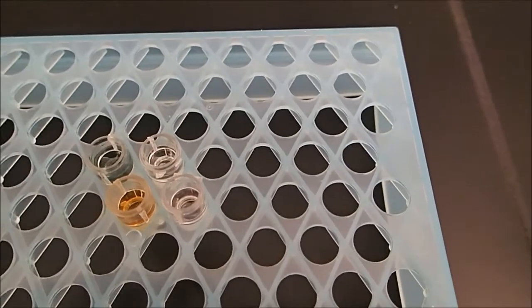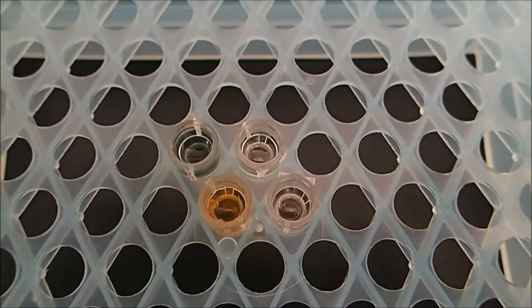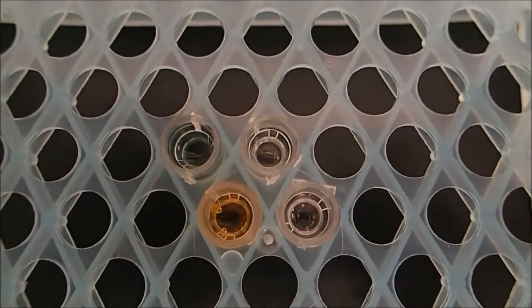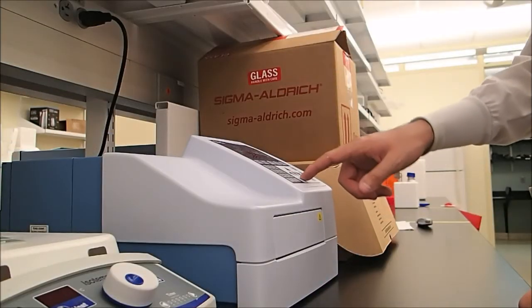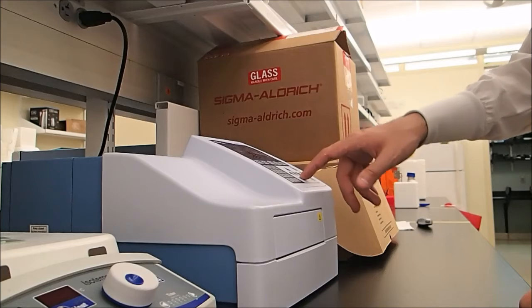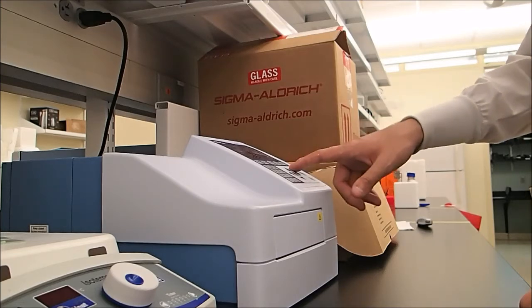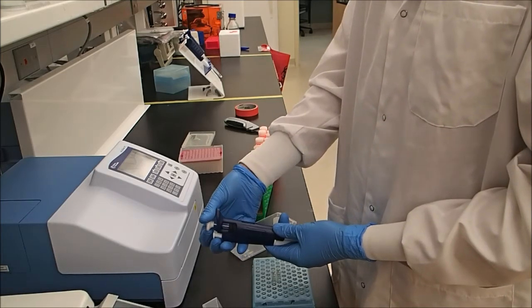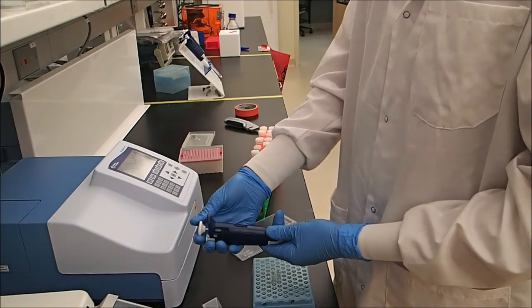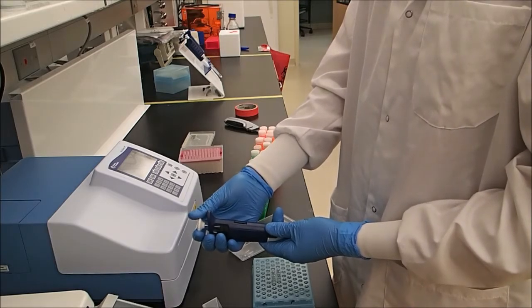But the basic principle is that when antigens interact with antibodies, the color of the solution changes. The magnitude of this color change can be translated to a measure of the level of antibodies in the sample, which can then be used for medical diagnosis. Often, this test can be used to detect levels of progesterone, a sexual steroid that can be a sign of complications in early pregnancy among a wide variety of other things.